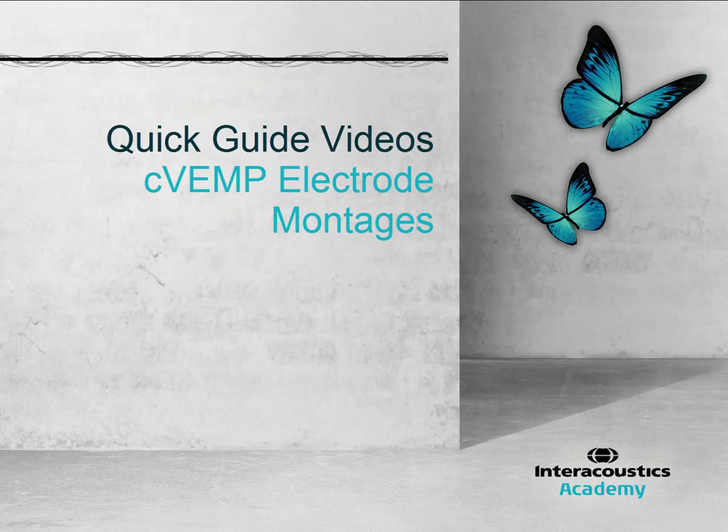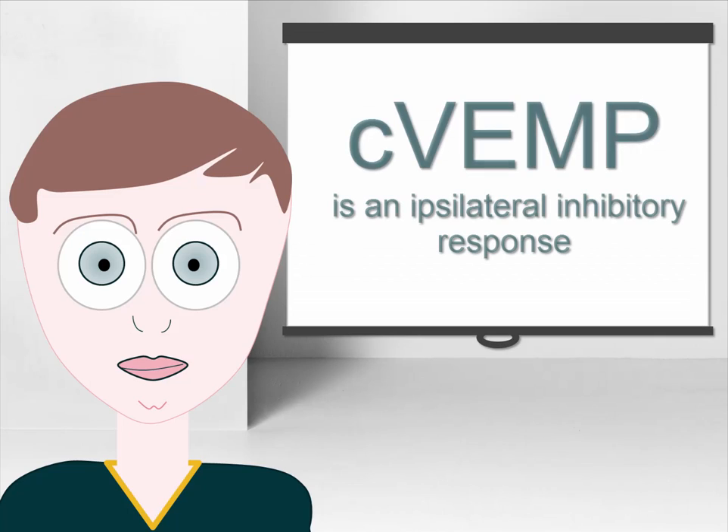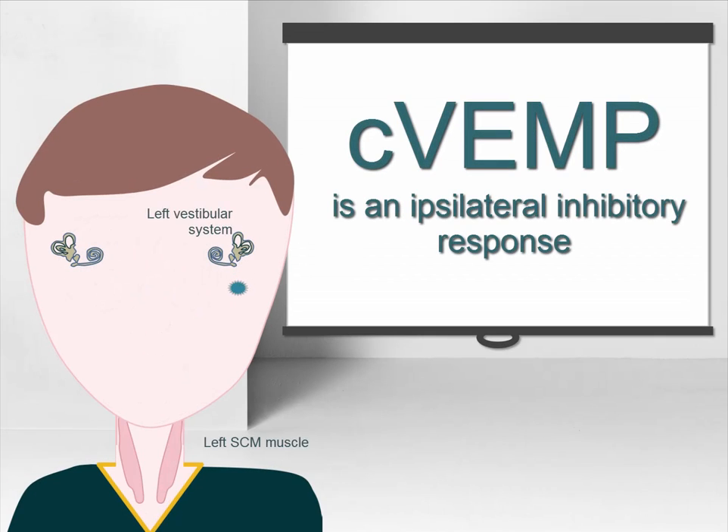This quick guide video provides an overview of how to position the electrodes when performing CVEMP testing. The CVEMP is an ipsilateral response, meaning that stimulation of the left vestibular system results in the inhibition of the left sternocleidomastoid muscle.